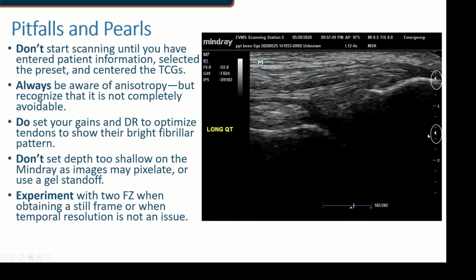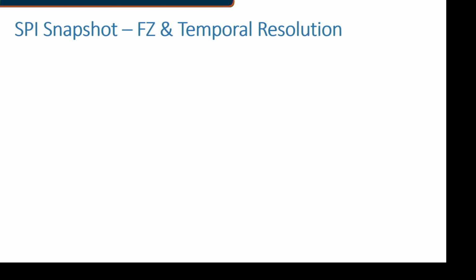But you can experiment with doing two, but just remember that if you're going to use focal zones, that's going to affect your temporal resolution. But if it's not an issue, if you're just focusing on one spot, temporal resolution is not an issue, go ahead and experiment with focal zones. Which brings me to our snapshot.